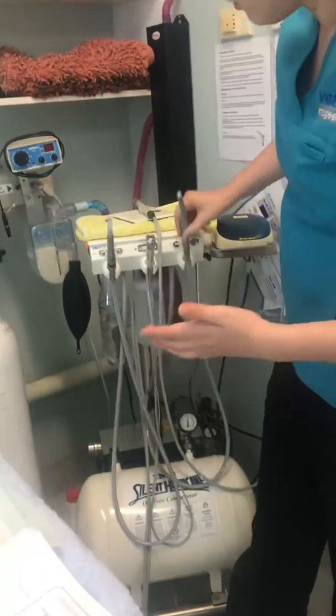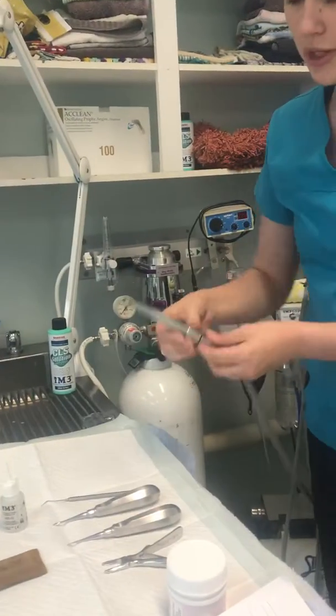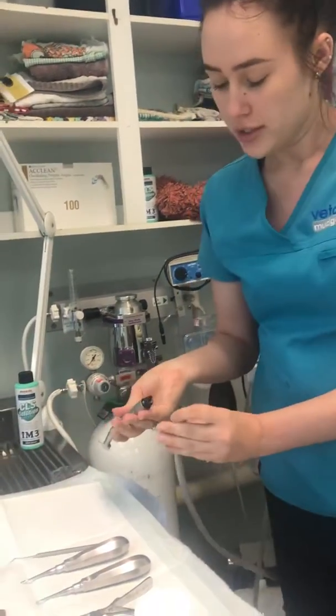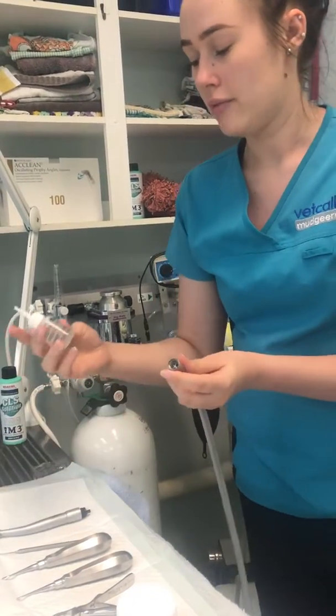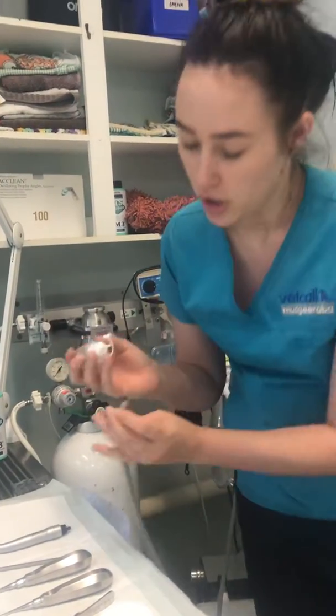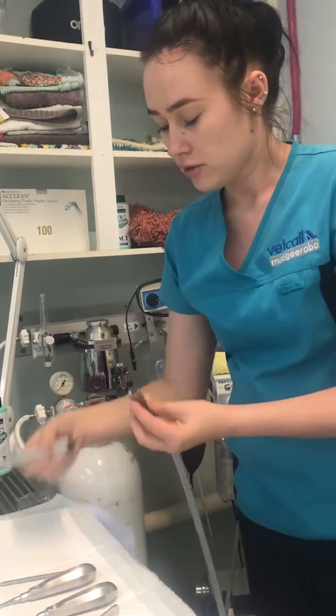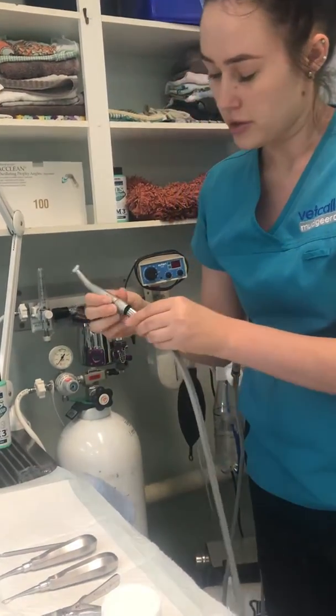And same for your drill. Now with your drill as well, you just want to make sure prior to using it that you have oiled it. So you just take off the top there, using your IM3 oil solution, you just put it into the base of that hole there. That's already been done, so I won't do that for you. I'll just pop it back on.